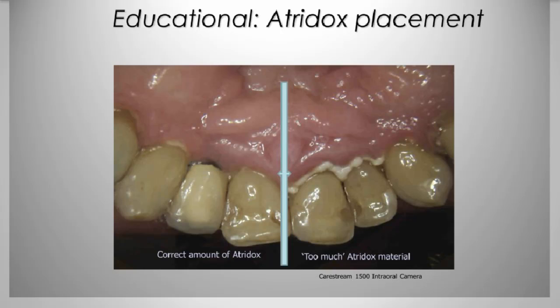You can't even see where it's placed, but it is underneath the gum line. So it was funny, between the morning and the afternoon, how much this hygienist's technique improved. So again, we can use this even in consulting. The intraoral camera is very, very useful. The key is, I think, blending the intraoral camera with caries detection. So that's where we're headed with this.